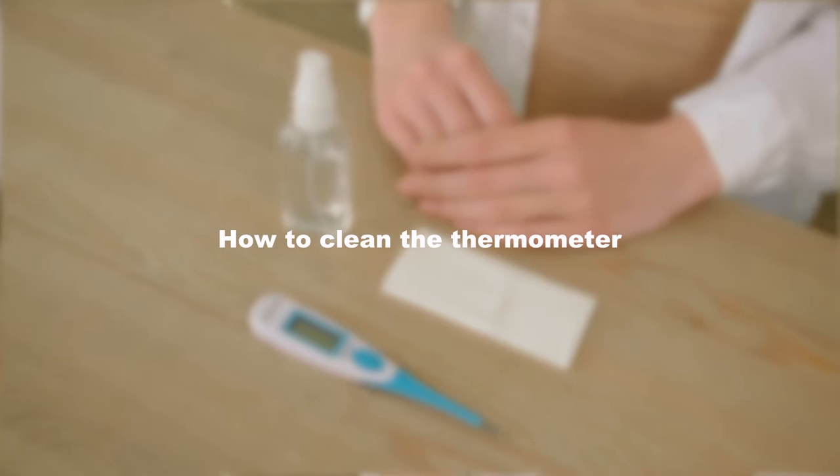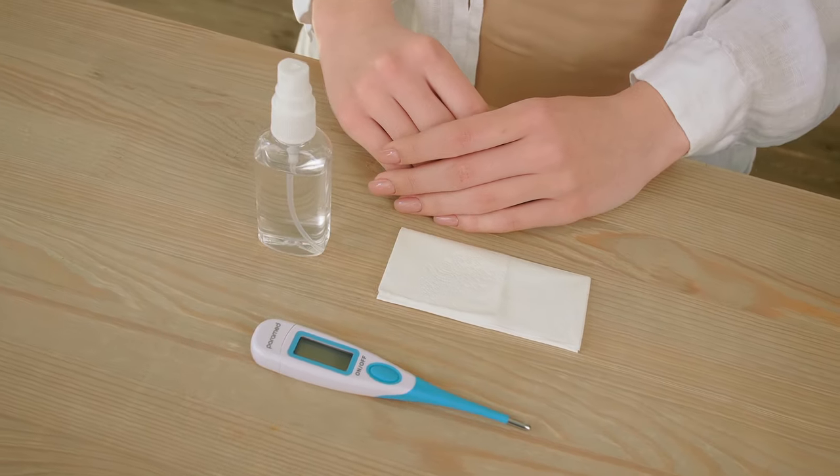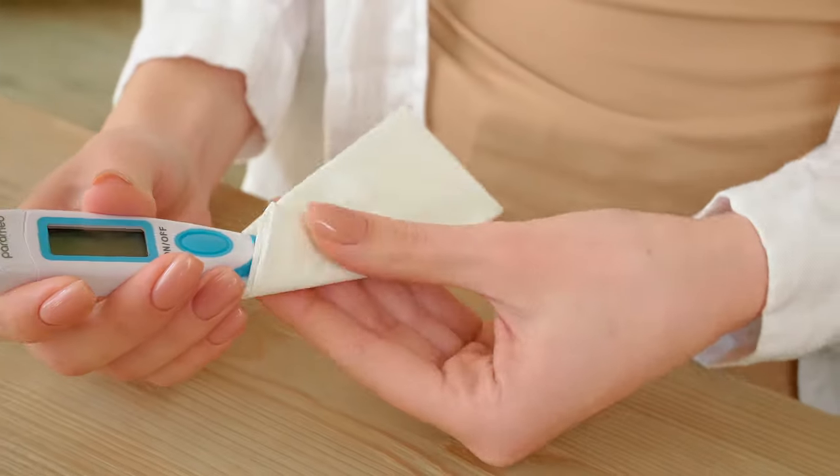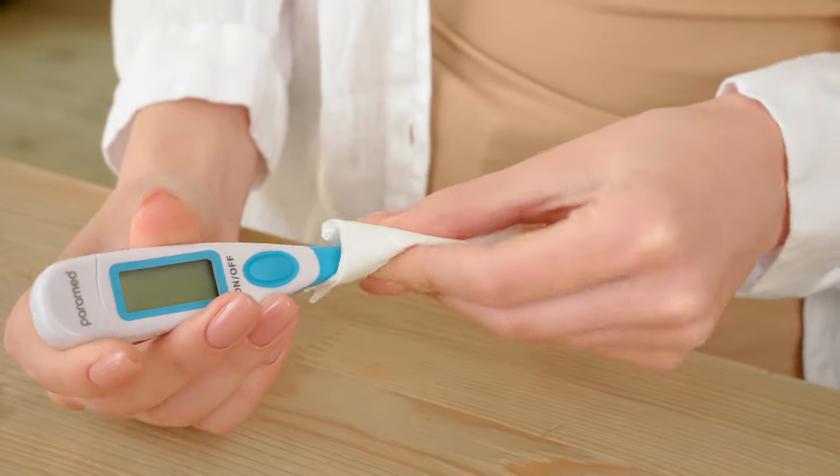How to clean the thermometer. The thermometer from Paramed is water resistant, therefore we advise you to wash it with cold soapy water before and after each use, or use a disinfectant.